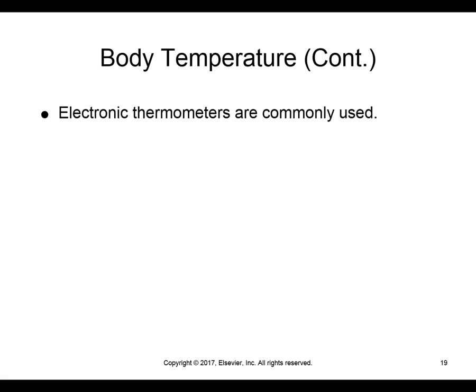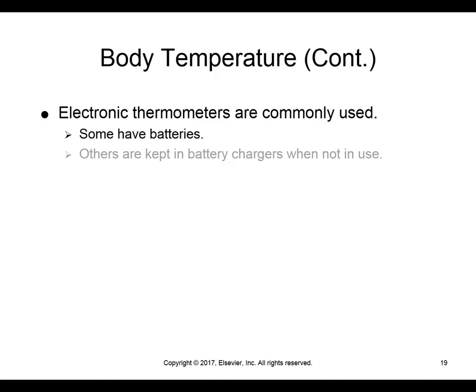Okay, so electronic thermometers are commonly used. Some have batteries. Others are kept in a battery charger when not in use, so that they're always at top battery charge when you go to use them. It's important with the ones that have battery chargers that after you're done, you bring the thermometer back to the battery charger.